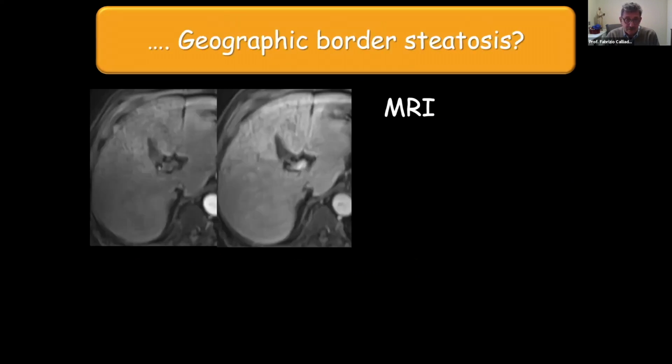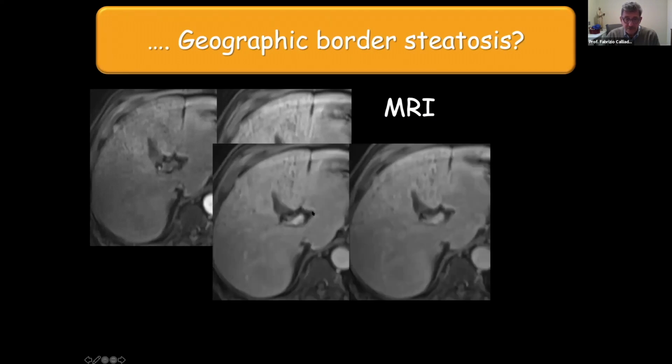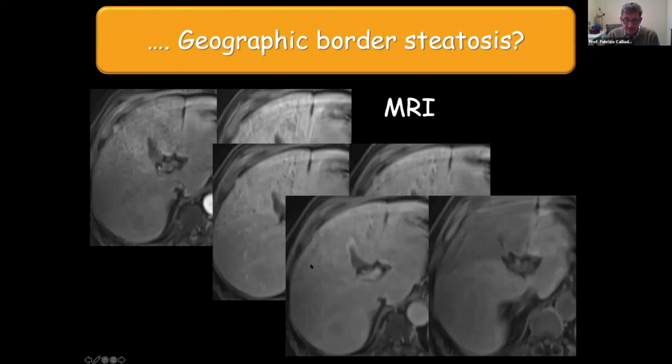And we have done contrast with MRI. So I have the contrast acquired in arterial phase and still contrast in portal phase, and washout, still contrast in late phase, but in biliary phase there is a washout. So the biopsy showed a cholangiocellular carcinoma.